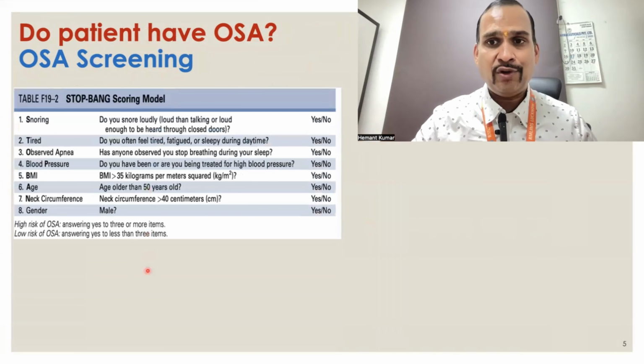are seen more prominently in central lead C4. Alpha rhythm is best seen in the occipital leads. So every wave has some characteristic feature which can be appreciated in a particular lead. That's why we are using a minimum of three leads, with reference to the mastoid. Why a reference is required, I'll show you when we do the hookup in the next lecture.